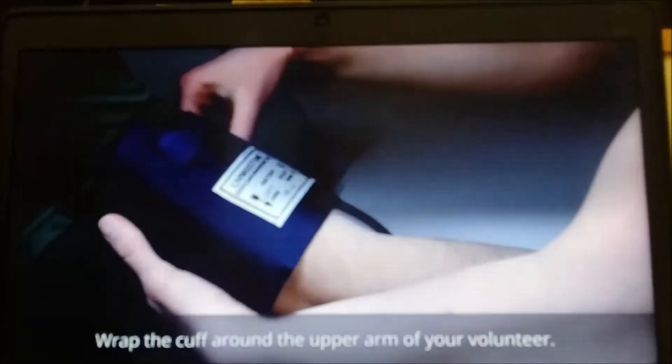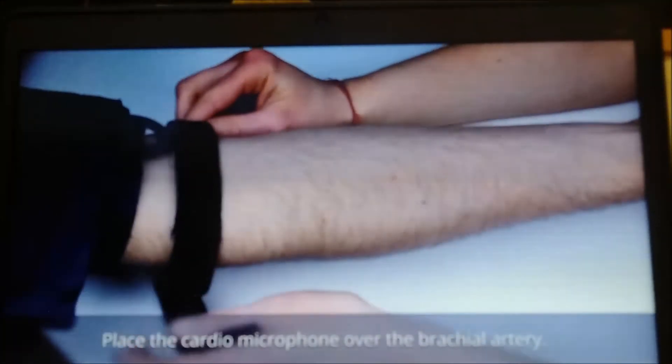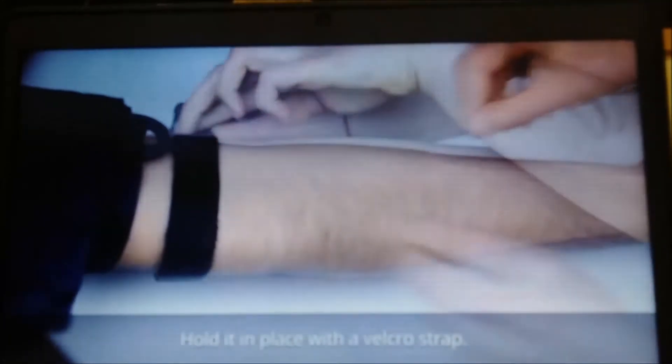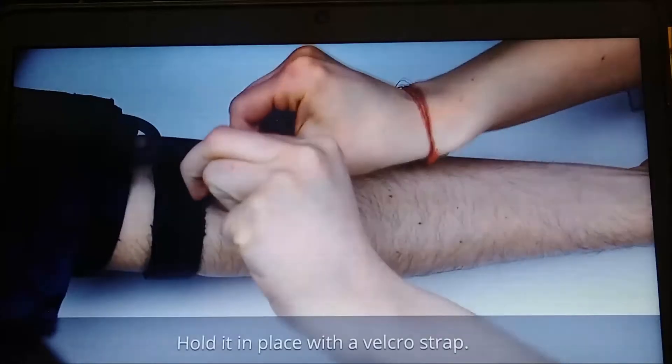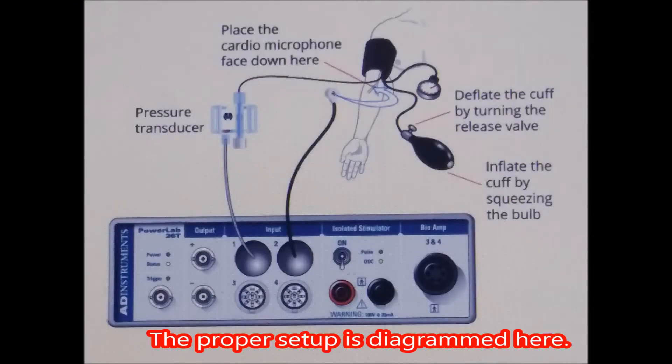Wrap the cuff around the upper arm of your volunteer. Place the cardio microphone over the brachial artery. Hold it in place with a Velcro strap. The proper setup is diagrammed here.